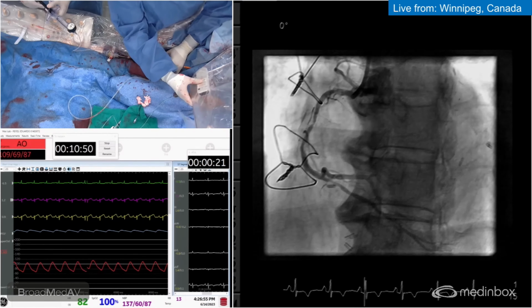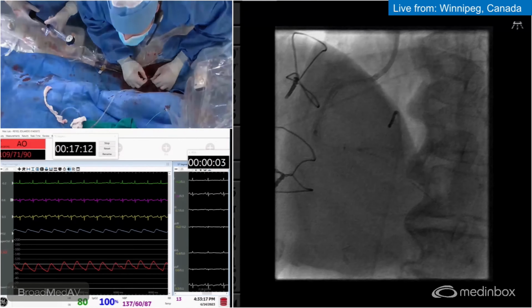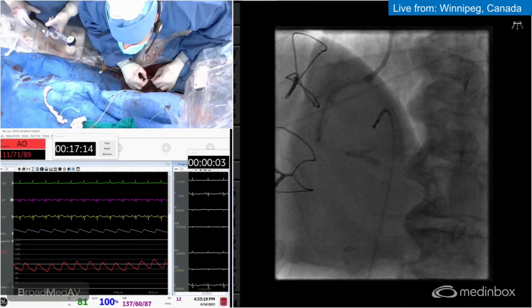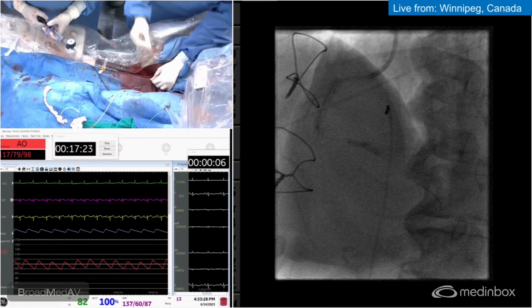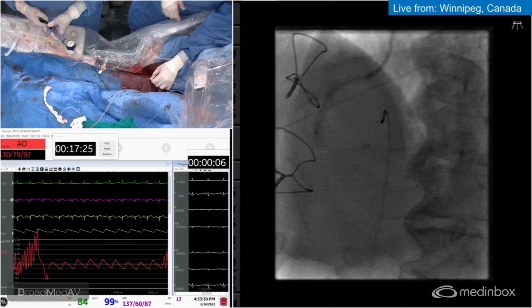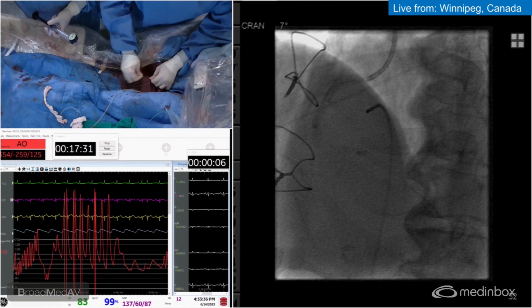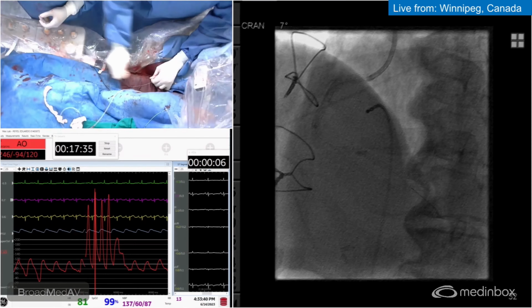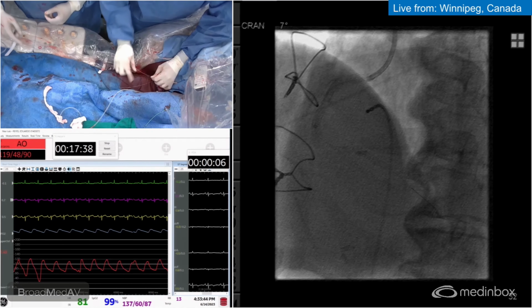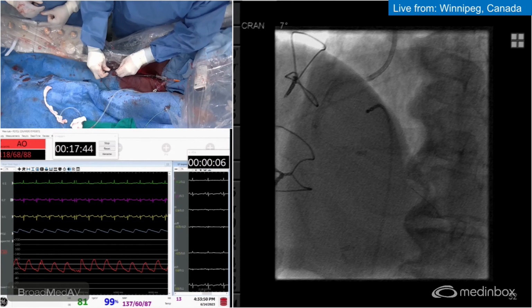Now that you have the guideliner in, I think we should not lose territory gained. Yeah, I would go with a 3.5 long. We don't need to go high pressure there. No, that's good. It's just we did for the distal RC. We just want to make sure the stents are apposed and well expanded, and it's in a relatively healthy segment, so it's not like it's at any risk there. Okay. 20, yeah. What do you think of the mid 3.75 for that whole mid segment? Yeah, so we'll do the 3.5 POT for the distal stent. We'll do the 3.75 NC for the main stent through its length, or at least the mid stent, and then we'll do an OCT run, and then hopefully we're done.